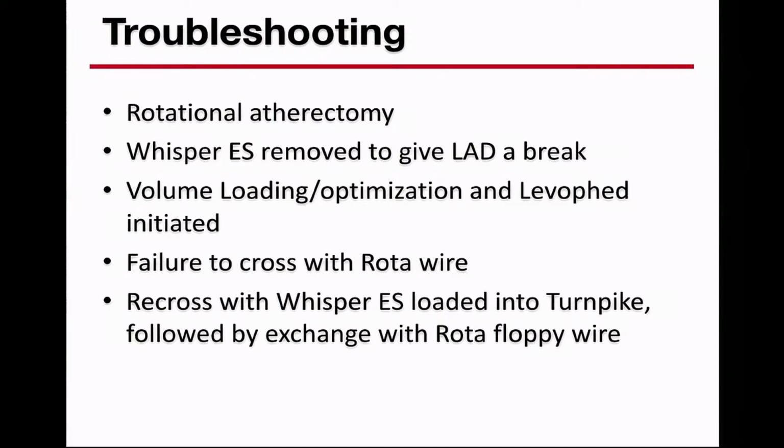And we started small doses of Levophed. It's just important that when you start Levophed, make sure you're properly volume loaded. Because if not... You didn't put a Swan-Ganz to monitor that? We did not put a Swan-Ganz. Yeah, that's one... I think the thing I've learned is that Impella means Swan-Ganz. Because as soon as you start your Impella, you always have issues with volume.